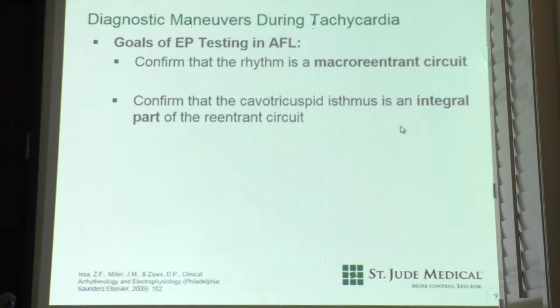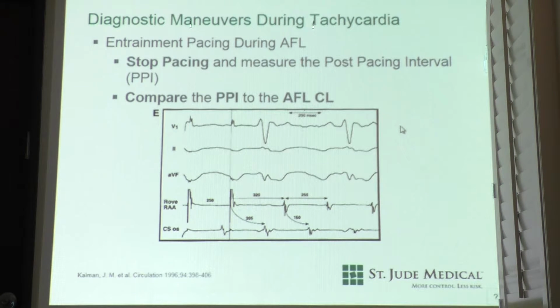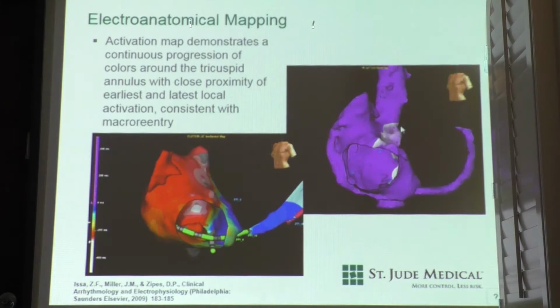All right. So once we are able to accomplish block, often we're just talking about mapping tools here that we use to determine whether or not we're actually in the right circuit, if it's coming from the right or the left.